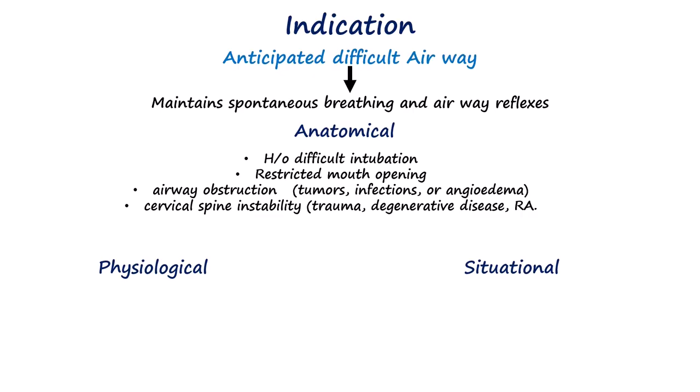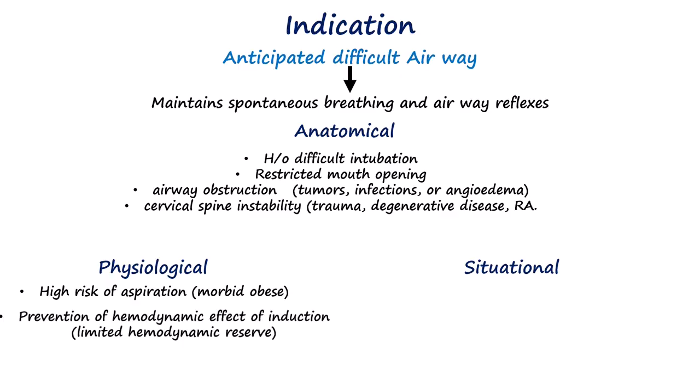Physiological considerations include patients at high risk of aspiration, such as the morbidly obese, as well as critically ill patients with limited physiological reserve in whom the hemodynamic effects of induction must be avoided. Special circumstances include cases where immediate neurological assessment is required after intubation, since the patient remains awake and can be evaluated without interference from anesthetic agents.